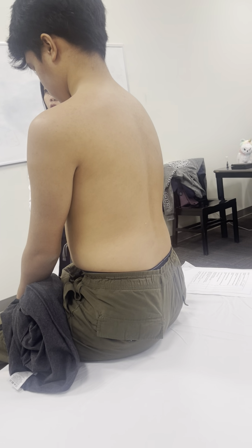So with the use of my diaphragm, I listen to your lung fields, and most of it, the breath sounds should be normal.